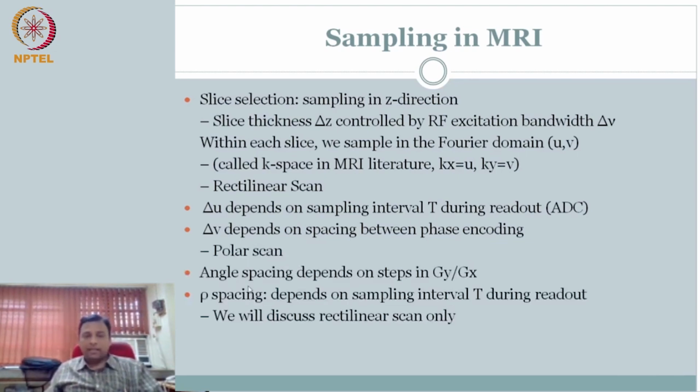In case of polar scan, likewise, you have an angle that is discretized. You saw the theta steps, so it's already vivid that you have discretization. But there also, along the radial direction, we put a straight line, we didn't put points. Essentially it is points, but we have been using a line. So the sampling is also there, so delta rho should be there. For the purposes of covering the topic and giving this intuition, we will stick with the rectilinear scans only in the discussion going forward.